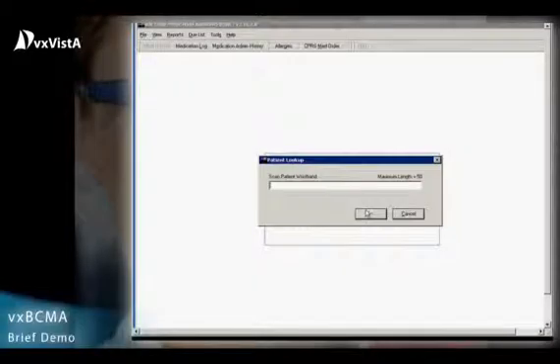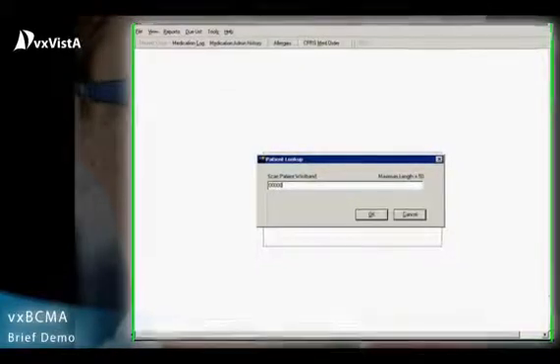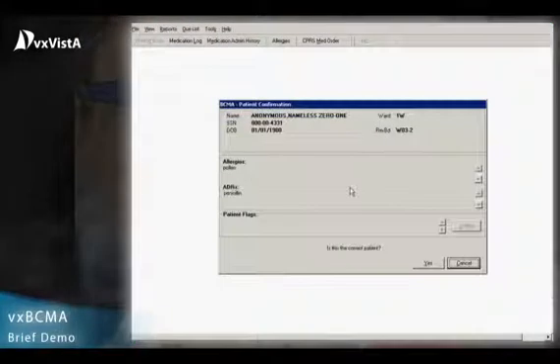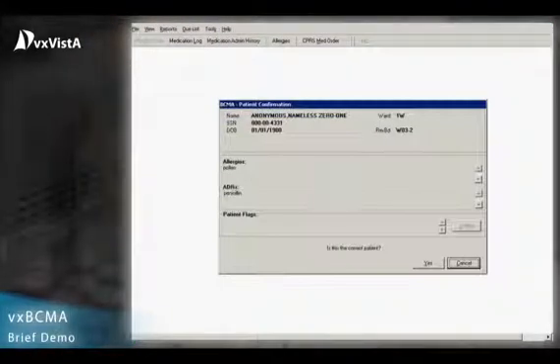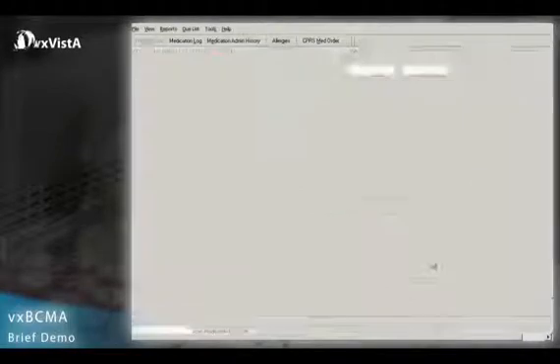The VXBCMA, or Bar-Code Medication Administration System, was originally developed by the Veterans Affairs Department and has been adapted for use by DSS for VXVISTA.